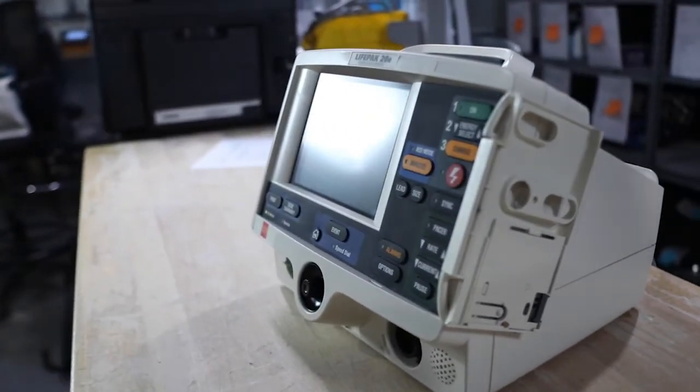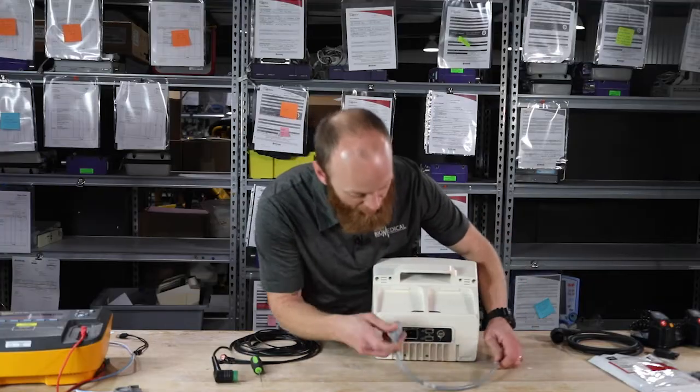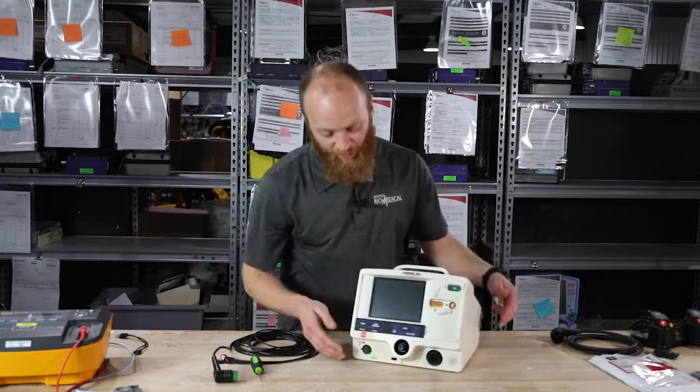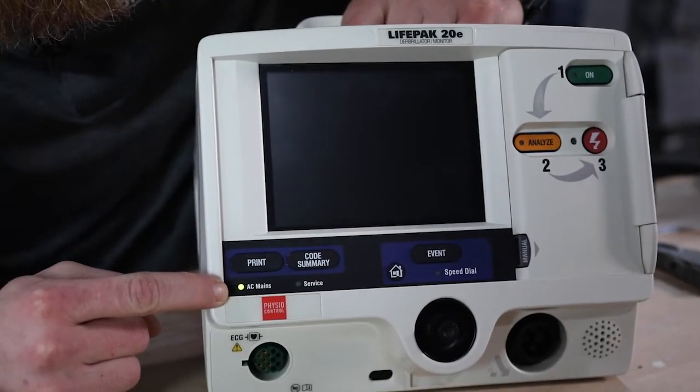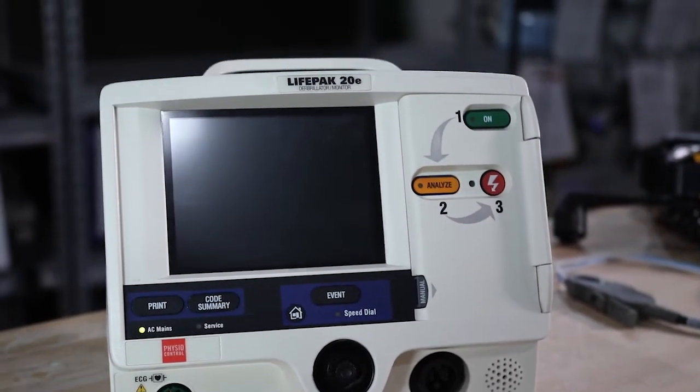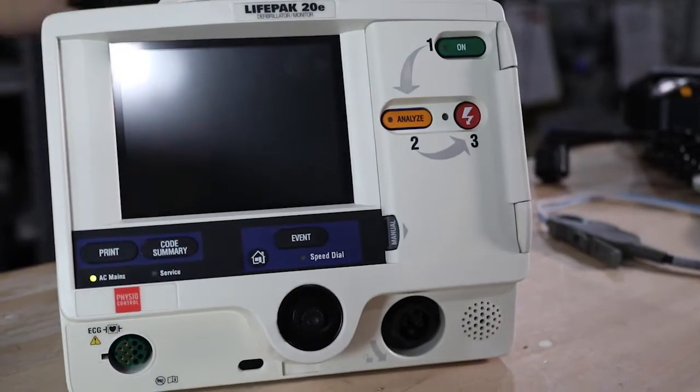Next, we're going to plug it in. In the back, it's your standard three-prong power cord. When plugged in, your AC mains light turns green, letting you know it is getting power and the battery is charging.